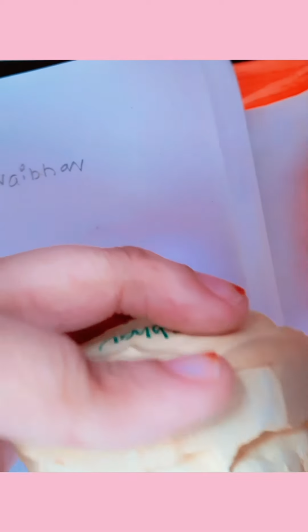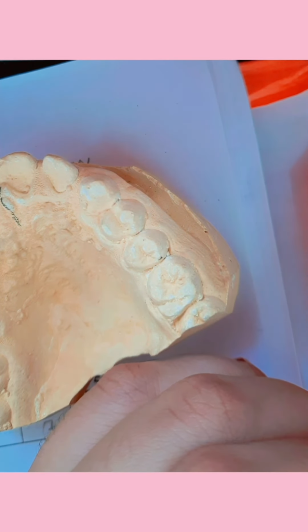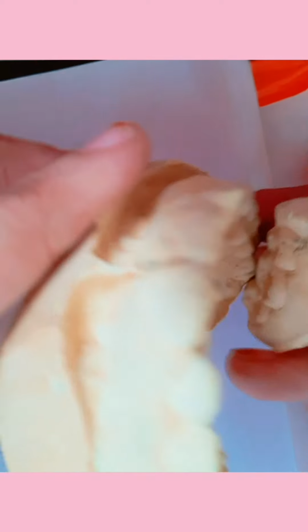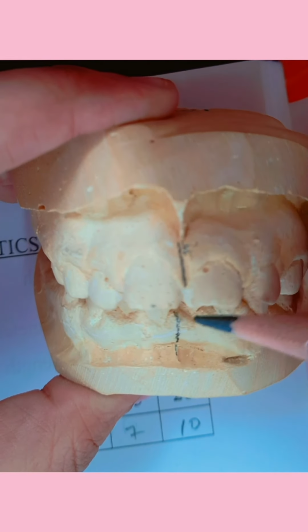Now we see if the midline is shifted or is coinciding or is in center on the knot. So you just draw it with the help of a pencil on the cast from the frenum and see if it is lying exactly in the center or not. Occlude the cast and you can ensure that they are coinciding. If not, then you can write the midline is shifted to the left or right. But yes, it is coinciding. So it's in the midline. Midline is not shifted, right?